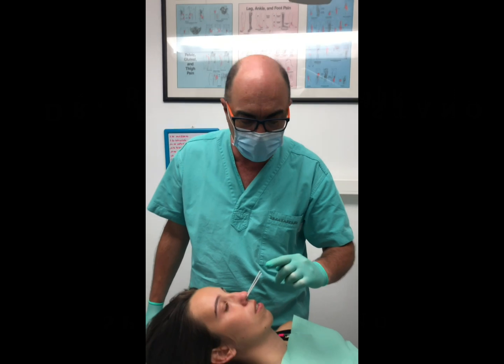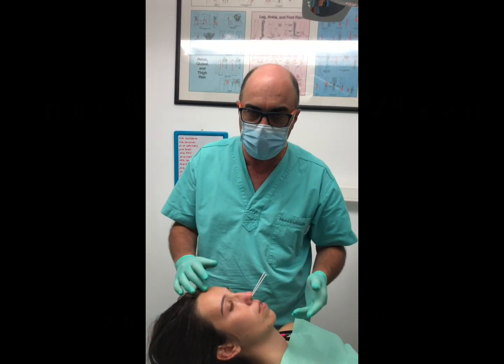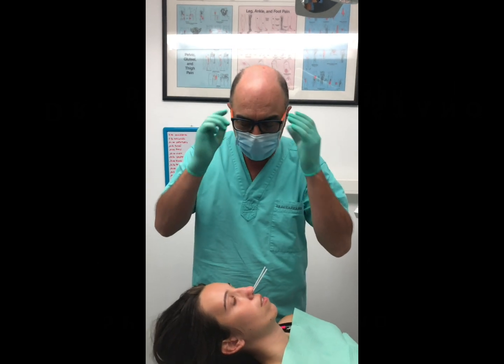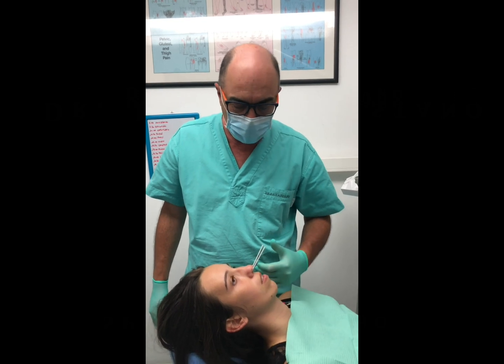We ask the patient to tap-tap — go ahead and tap-tap. Now she's having a severe headache; the objective here is to get that headache away and have her TMJ problem go away.